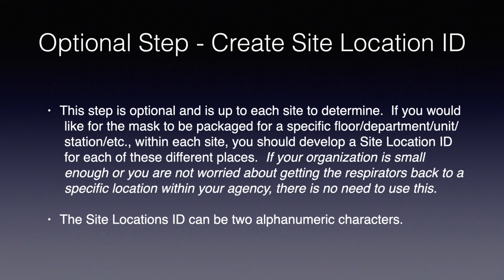The next step is completely optional, and that is to create a site location ID. If you would like for the clean mask to be packaged for a specific floor, department, unit, or station within your facility, you should develop a site location ID for each of these different places. The site location ID can be 2 alpha or numeric characters.